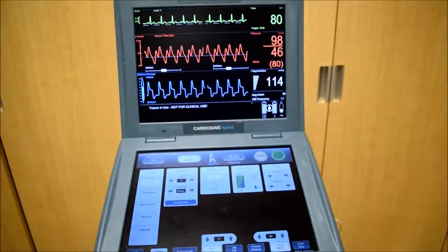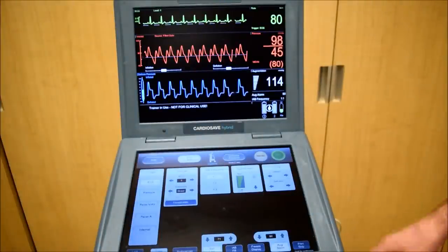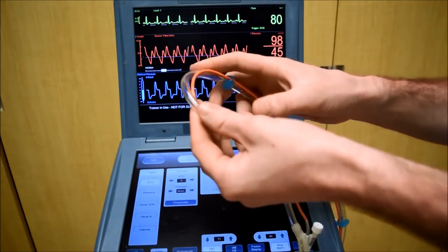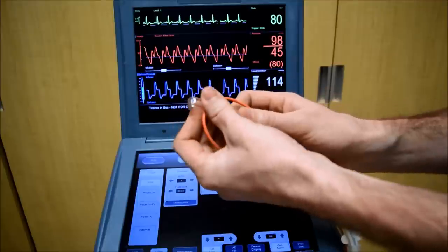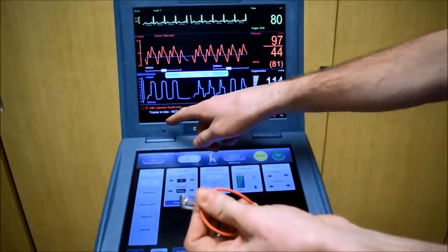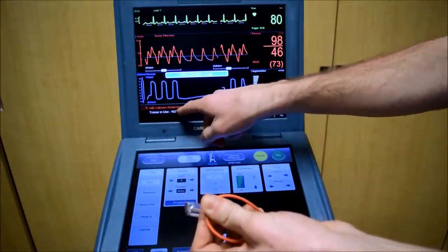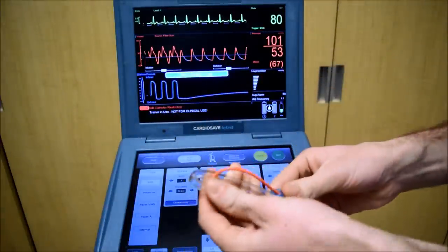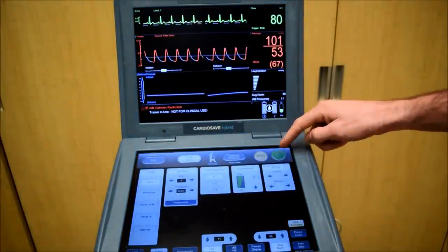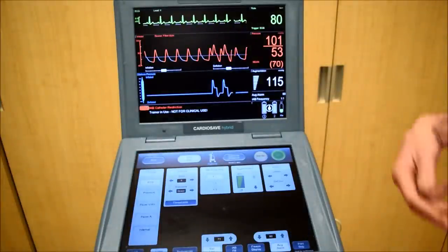I'd like to cover some alarms you may encounter. For example, if the balloon catheter line is kinked, an alarm will appear: balloon catheter restriction. Remove the kink and press start — the balloon will now resume.